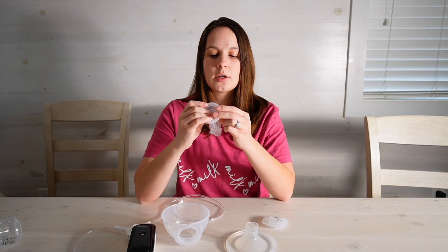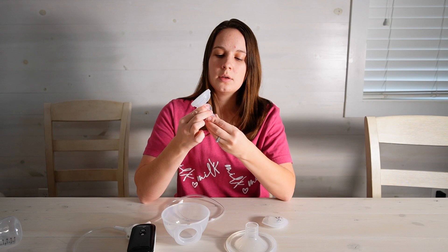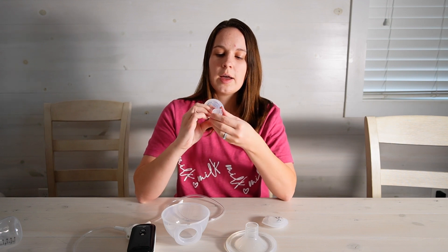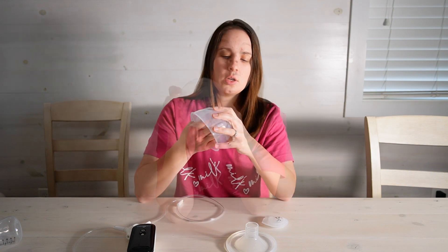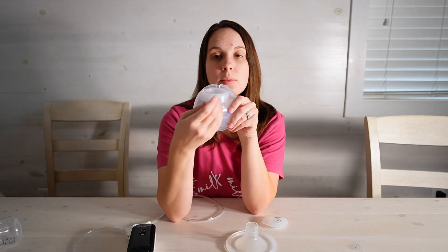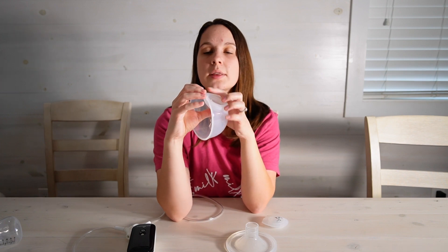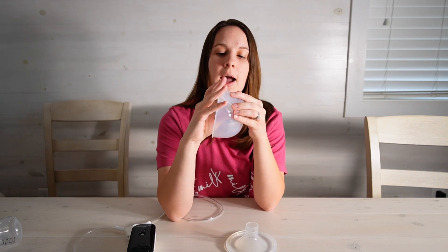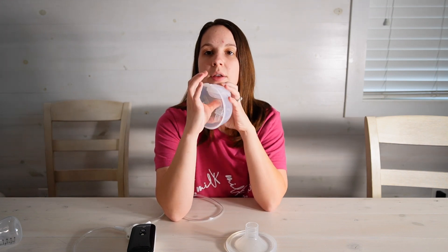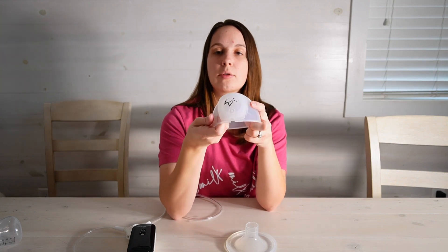The backflow protector goes in — you want to make sure it's clipped down all the way. Then the duckbill valve, and you want to make sure it is in line with the built-in guides that are here. Make sure you push this all the way up so it's sitting completely flush. While you're here go ahead and take your cap and add it to the top while still pushing up to make sure everything is pushed together really well.